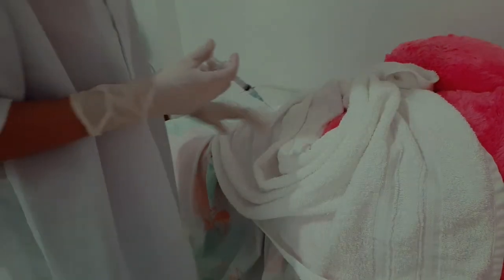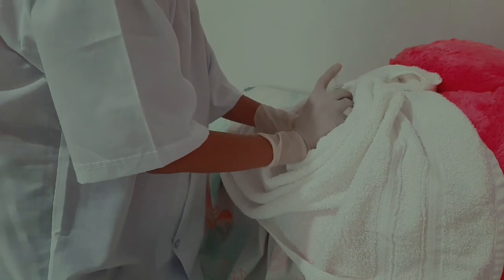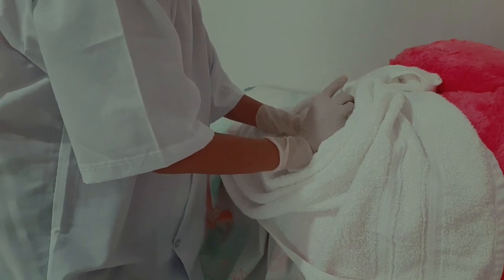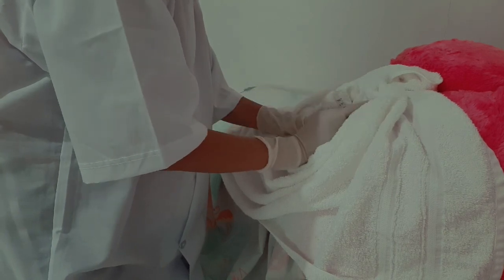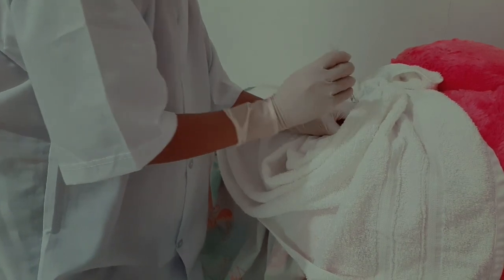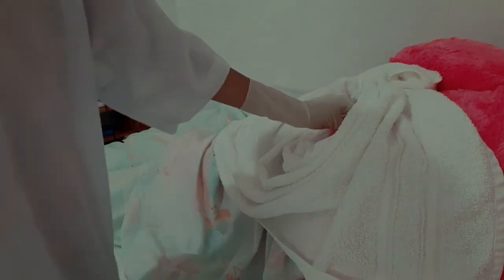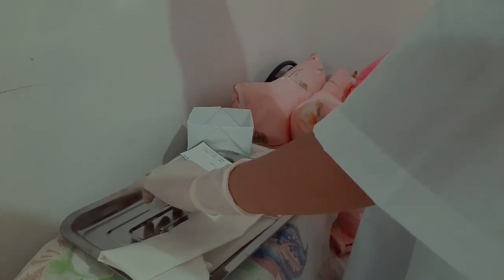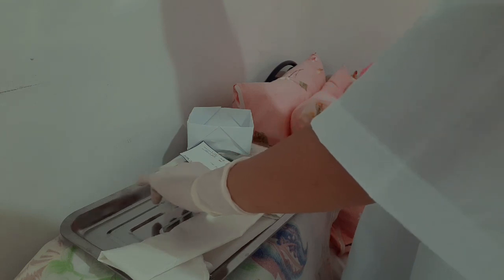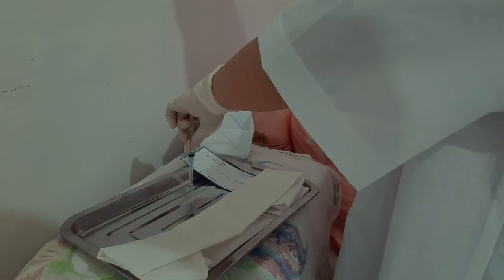Disinfect the injection site with inner to outer motion. Place the ulnar side of the left hand and grasp the tissue using the thumb and index finger, with the right hand holding the syringe between thumb and forefinger. Inject the needle quickly into the tissue at a 90-degree angle. Aspirate to check that the needle is not in a blood vessel. If blood is not drawn, inject the medication slowly. After injecting slowly, press the site with a cotton ball. Withdraw the needle quickly.